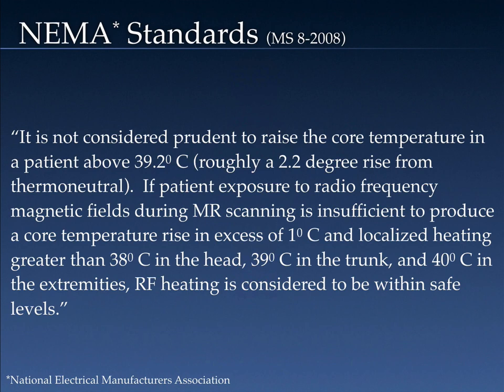If a patient's exposure to radio frequency magnetic fields during an MRI scan is insufficient to produce a core temperature rise in excess of 1 degree Celsius and localized heating greater than 38 degrees Celsius in the head, 39 degrees Celsius in the trunk, and 40 degrees Celsius in the extremities, then RF heating is considered to be within safe levels. Now, RF-induced heating is more peripheral. It's primarily due to magnetic induction, and there's very little deep body heating.